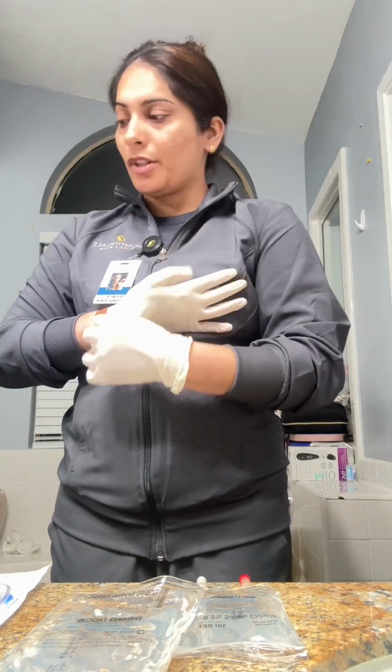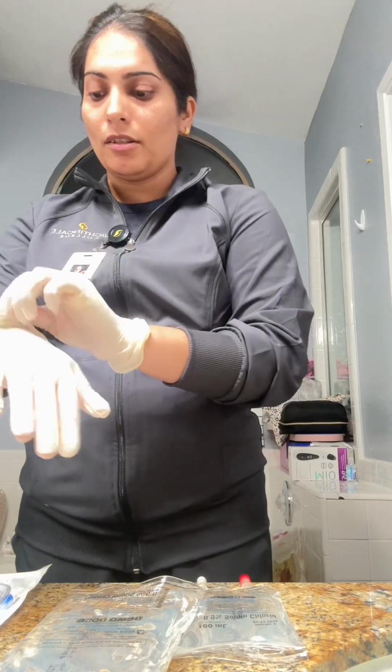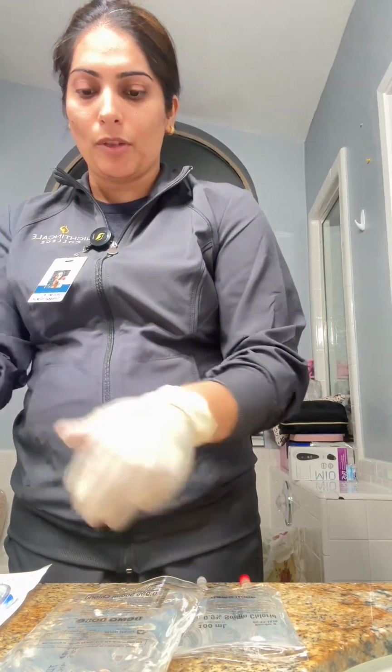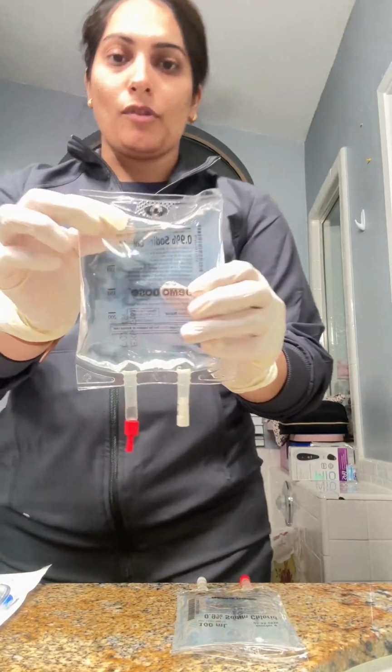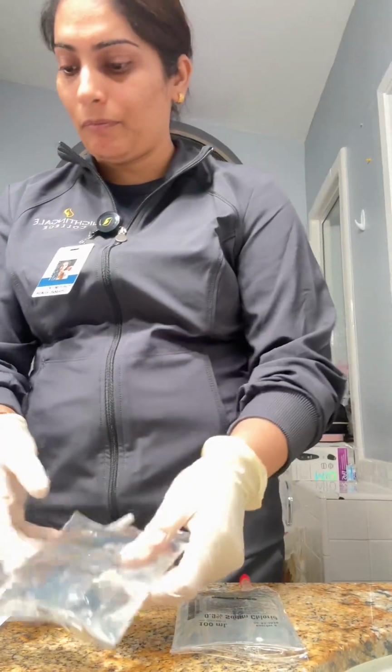And the patient will be receiving normal saline of 150 ml at 38 drops per minute, which is right here.